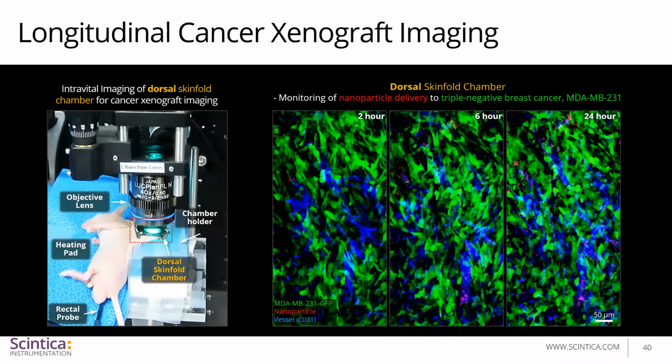Using the same window chamber model, you can also evaluate the treatment that targets the cancer cells directly, such as one delivered in nanoparticles. Even though they are very small, they can be visualized with confocal microscopy.